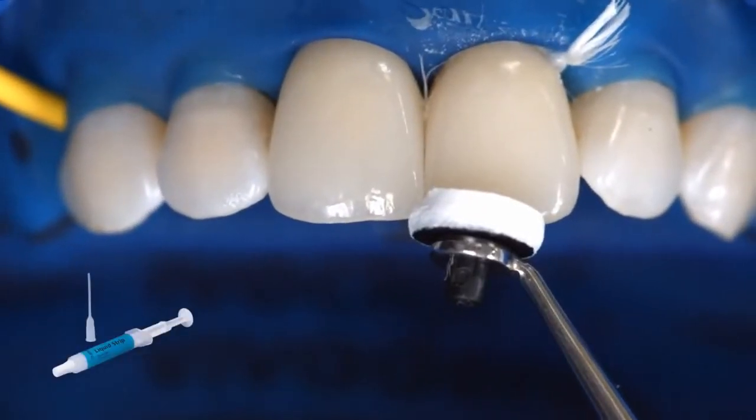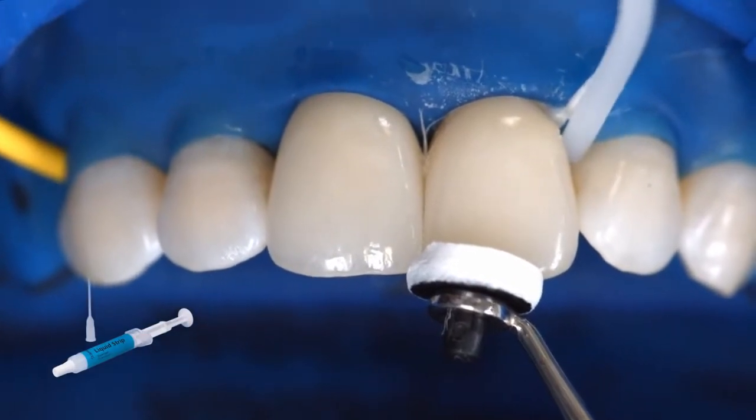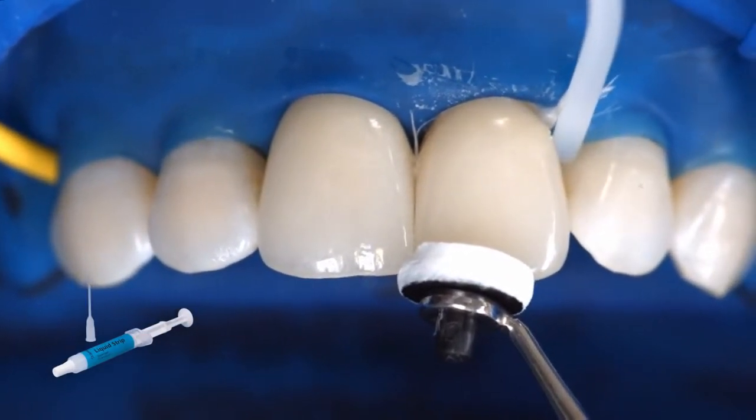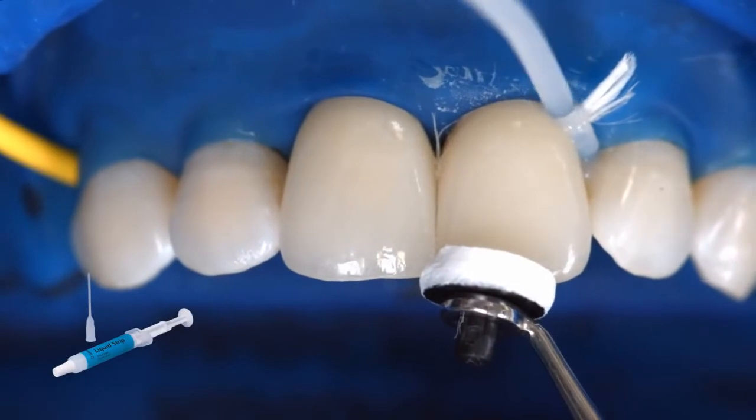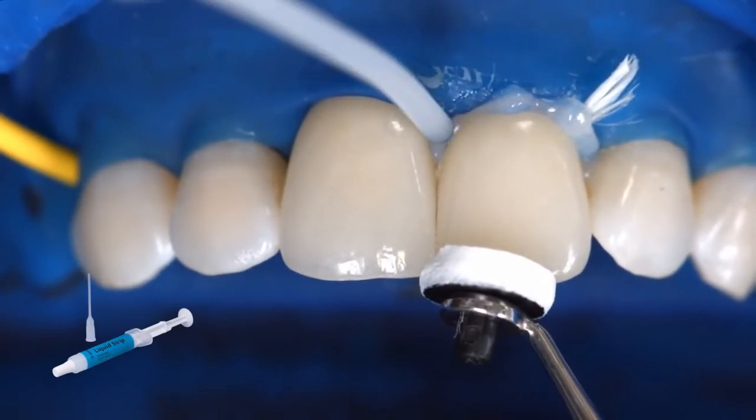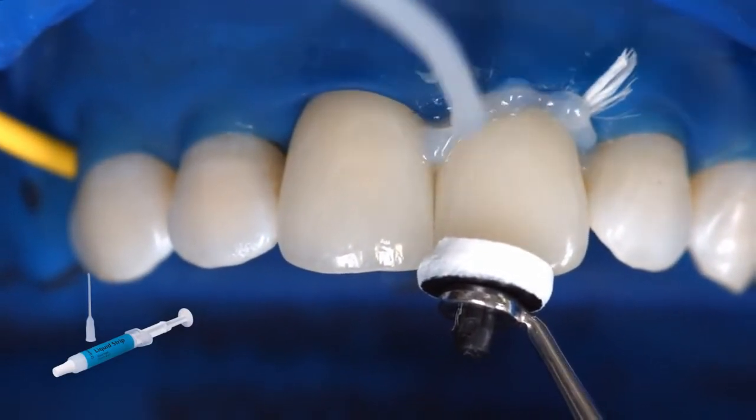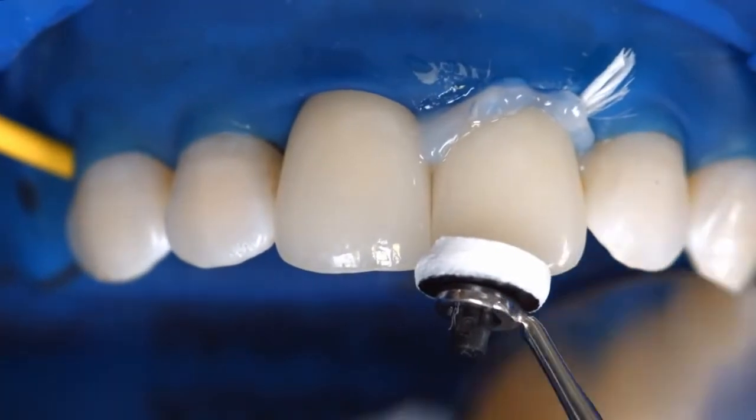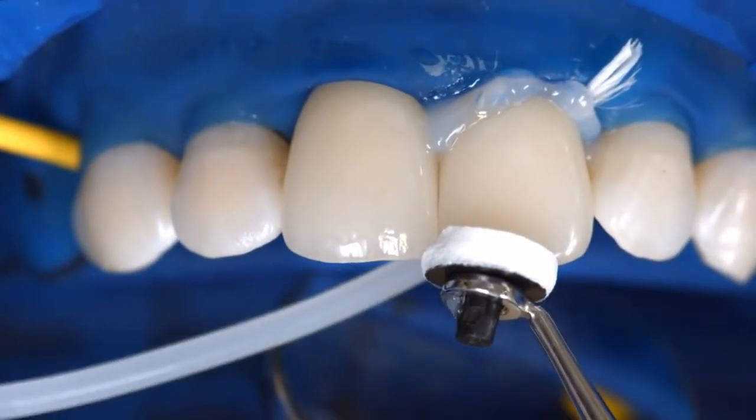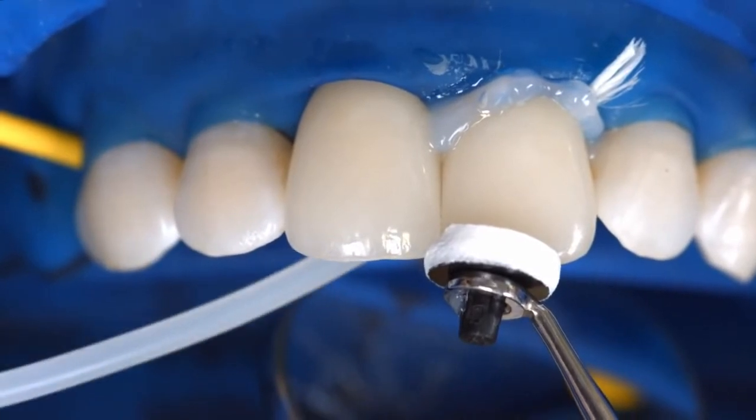Like all other composite resins, Variolink Aesthetic LC is subject to oxygen inhibition. To counteract this effect, cover the restoration margins with glycerin gel or air block immediately after having removed the excess cement. Liquid Strip is an ideal product for this purpose.